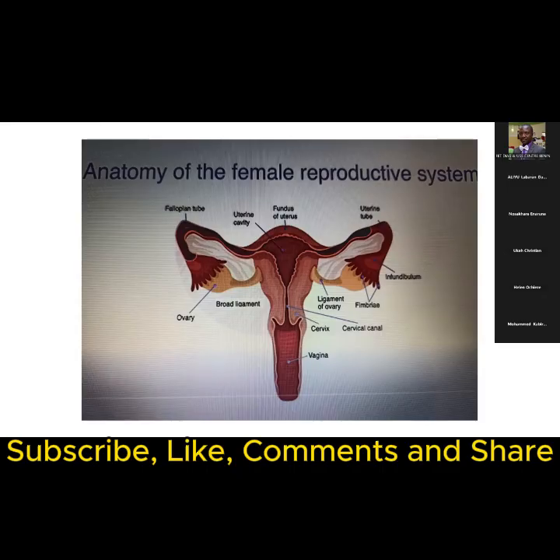And then the round ligament is often in front of these two structures. So it helps you sometimes in getting orientation, even at cesarean section, and not just for the purpose of scanning alone. There is a condensation of the broad ligaments you can appreciate on the sides, around the tube as well as the ovary, which form the mesovarium as well as the mesosalpinx.